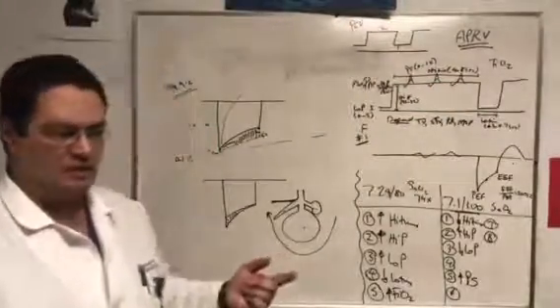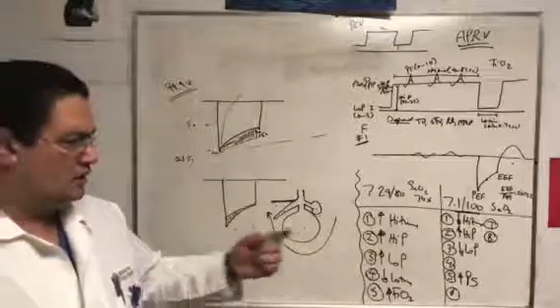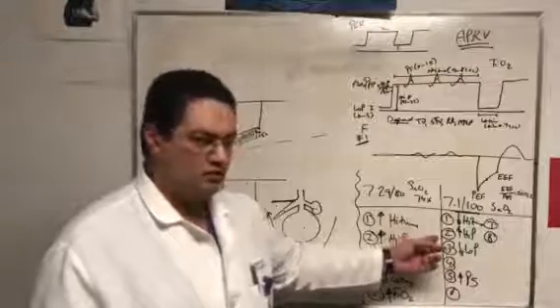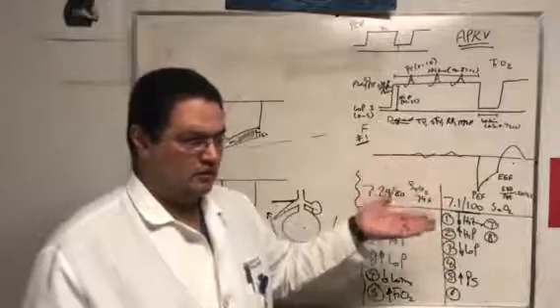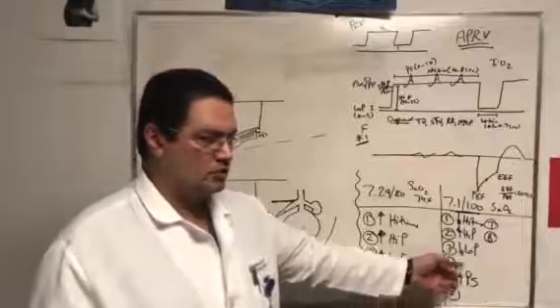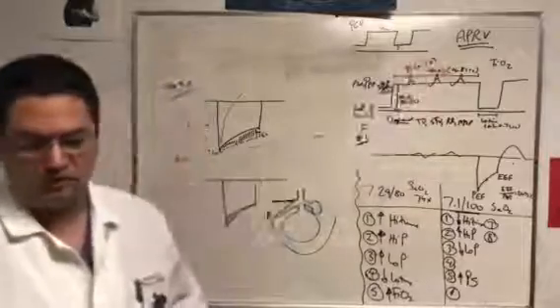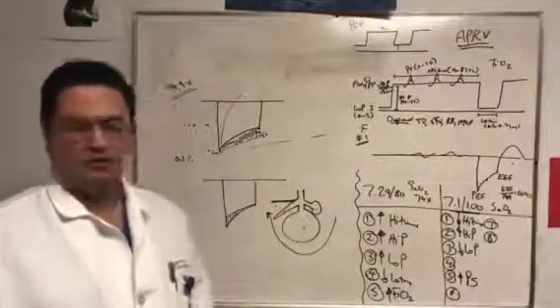But why is it number 5? It's not higher than that. For many reasons. Number 1 is that by the time you increase the high pressure, which is the most preferred, right? You go up to 35. If you add more pressure support to it, that will be above 35. We don't want to go above 35. That number, we don't want to, maybe will injure the lung, although there's debate, right?